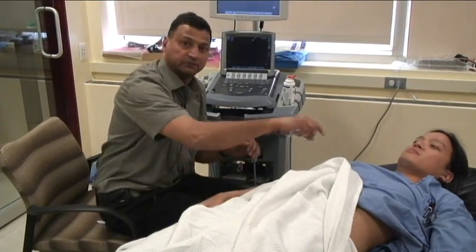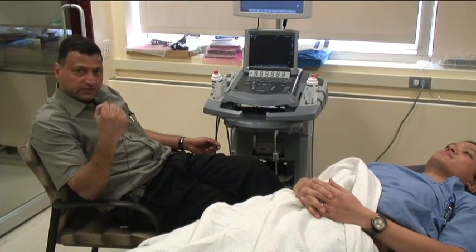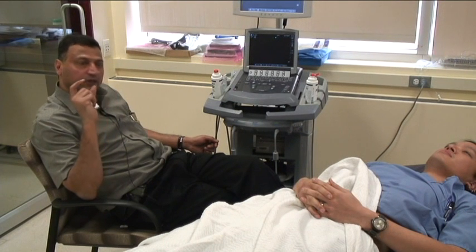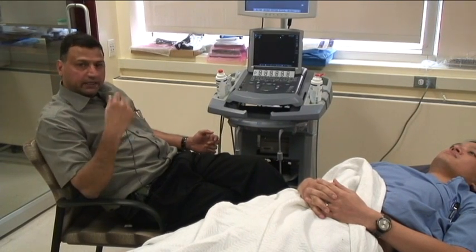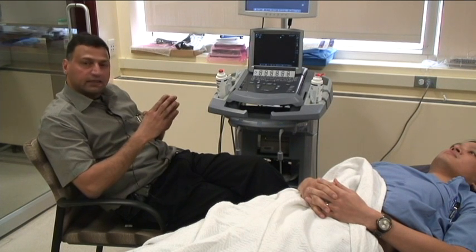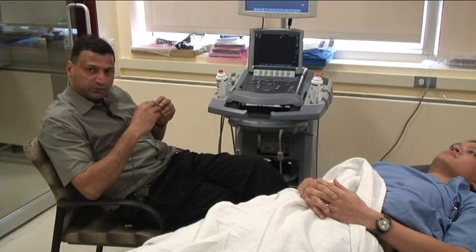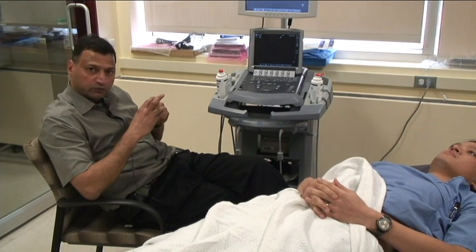So we saw how to get the subcostal view of the heart and get the IVC. And what we're using more and more is the IVC size and the collapsibility with respiration to indicate fluid responsiveness. There's a lot of data out there to show that if you have an IVC that is less in diameter and is 50% compressible, or has 50% change in variation, particularly in a spontaneously breathing patient on inspiration, this person might be fluid depleted and is likely to be fluid responsive.